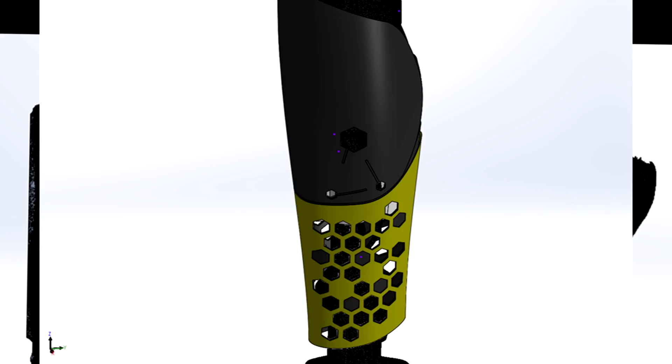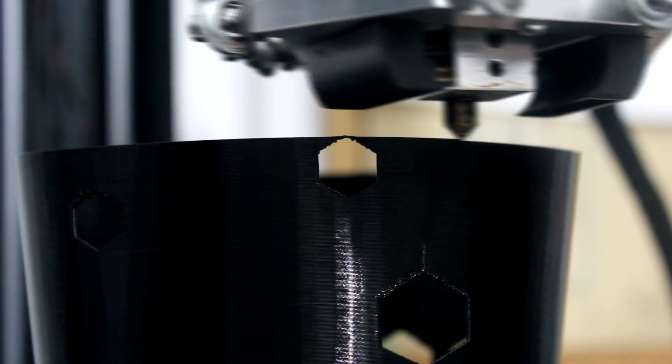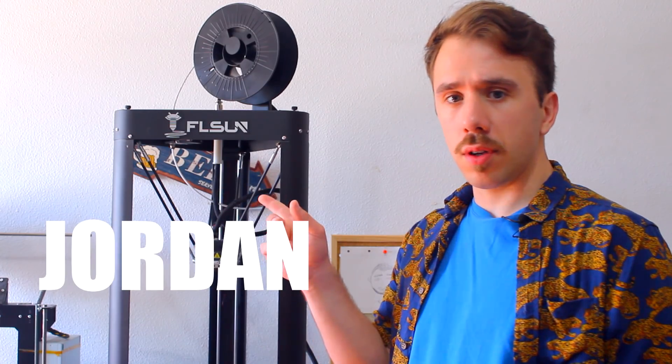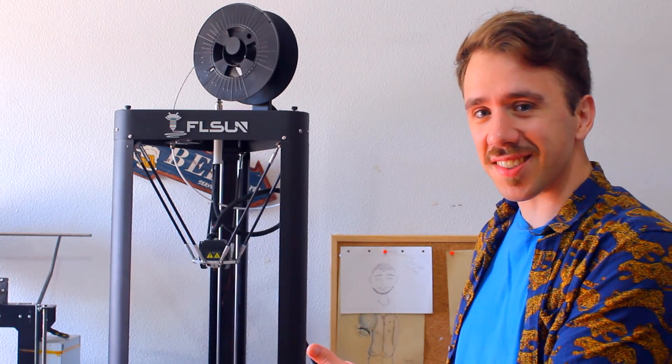In the end, I sent some pictures to Dominic and he loved it. After exporting all the models as STL files, all that remained was to 3D print them. And that is where this baby comes in. This is Jordan — well, his actual name is FLSUNQQ, but I baptized it Jordan because of how tall and black it is.